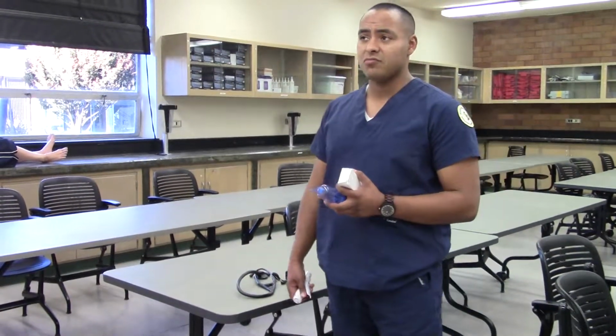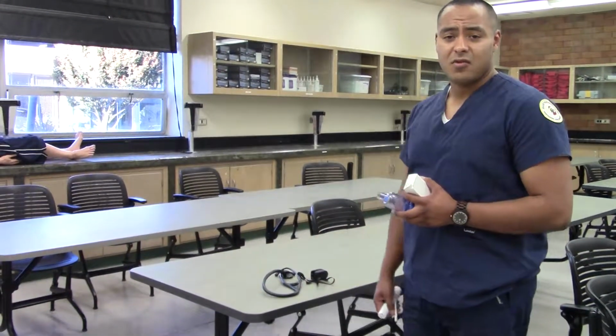Before you go in the room, you want to know the patient's name. You want to know the doctor's orders. You want to know any past x-rays. You want to know how long the patient's been in the hospital. You want to check vitals for any past trends. You want to just get to know the patient, any family members. You want to make sure you have your equipment ready, and you want to wash your hands when you walk in the room. Okay, so now I'm going to walk in the room.